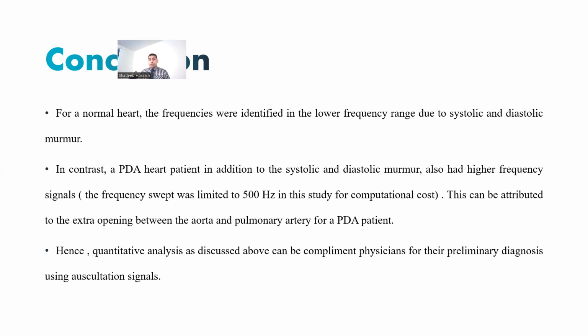We can apply machine learning and artificial intelligence to this process to make the system more automated. However, I suggest that this could be a good step to first get the ball rolling and help the specialist in identifying abnormal heart conditions.